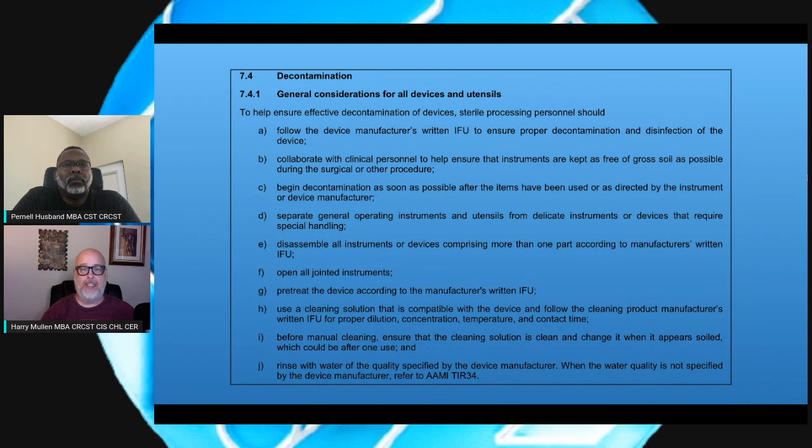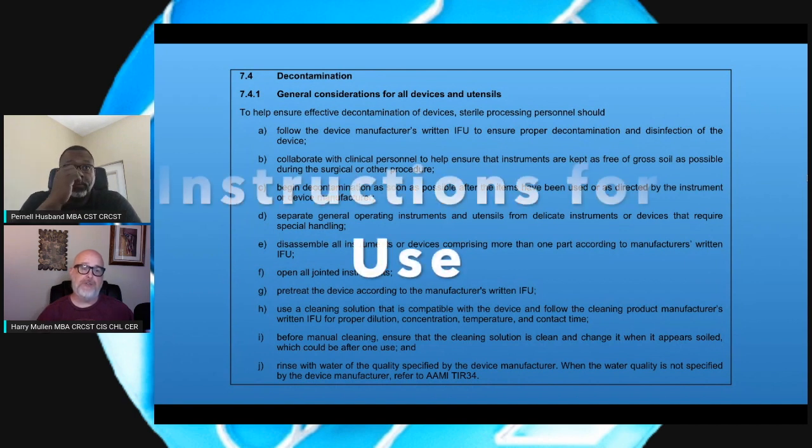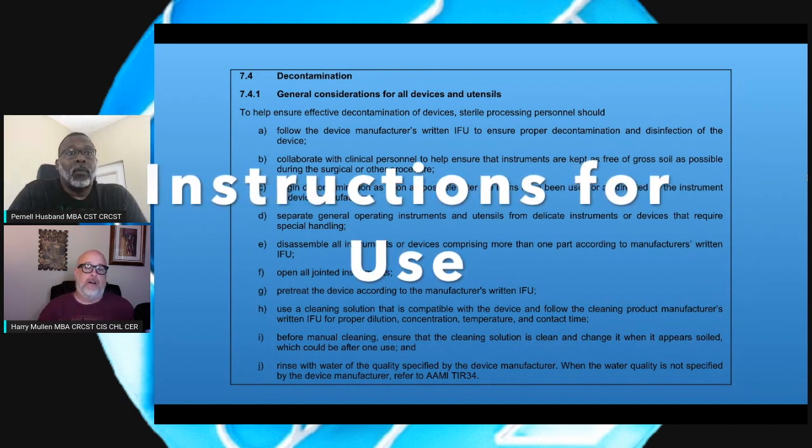So ultimately, again, it goes back to the manufacturer and what it is that they say their device and how it needs to be processed, which is going to dictate what type of materials are you going to use? What are the chemicals? What are the timelines? Does it need soaking? Scrubbing? How is it to be done? There's so much information that you need to make sure that you have access to these instructions for use within the decontamination area.